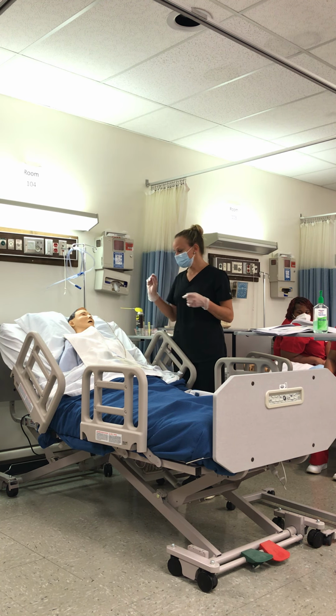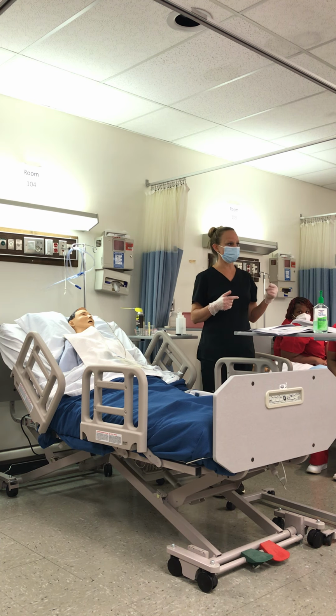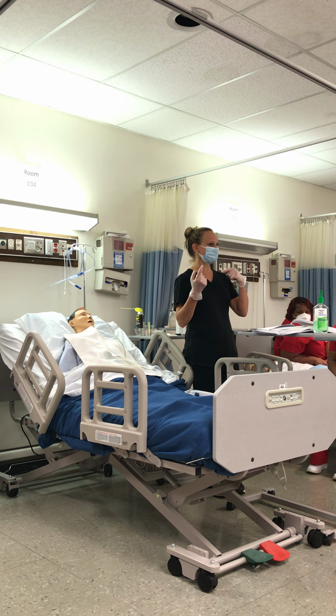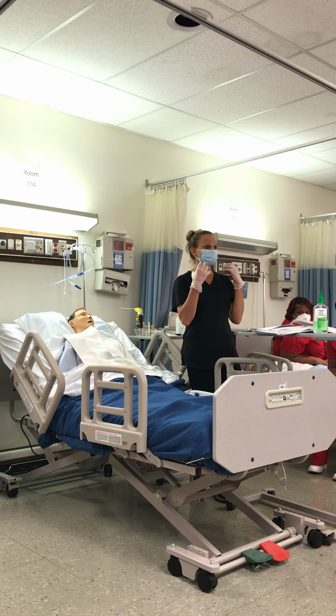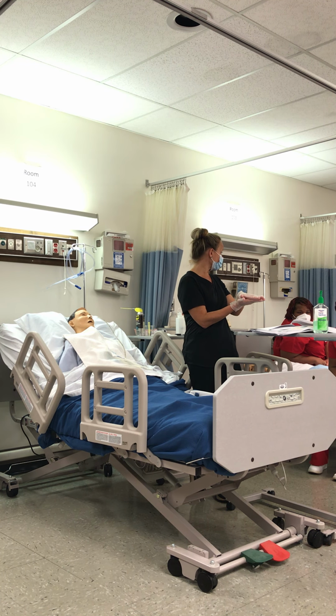Now, as they take a sip of water, what does that do to help us ensure we don't go into the respiratory tract? When they're swallowing, what's happening physiologically? It closes off the airway. When we drink, what happens? The epiglottis flaps down over that trachea, okay? So when we're passing that tube, that's why we're having them swallow.